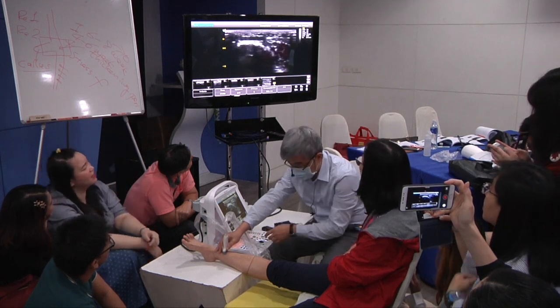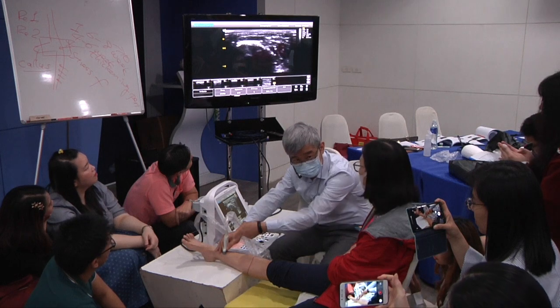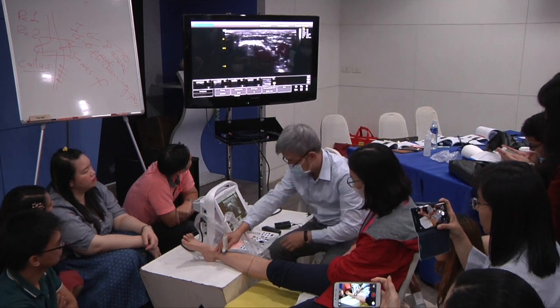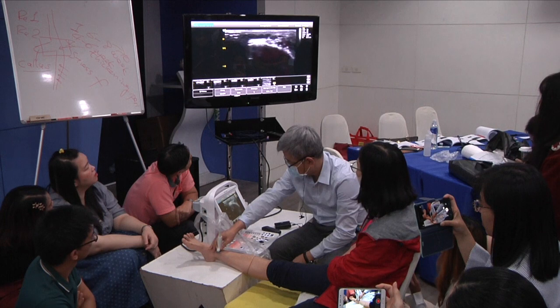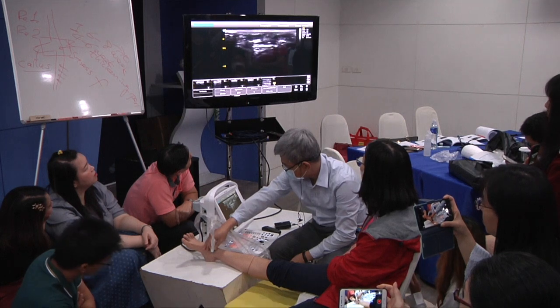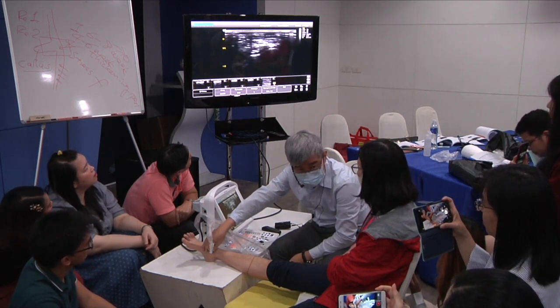Look at my hand. My hand is not in front of tibia anymore. I'm turning to the medial side, right? Because for you, I need to put the tibialis anterior tendon in the middle of the window. Okay. I think we are very close to the insertion.